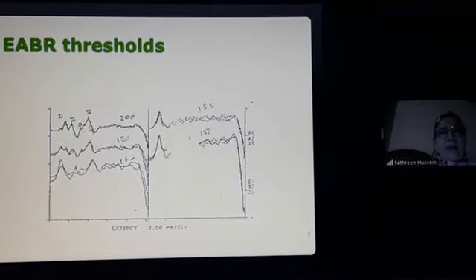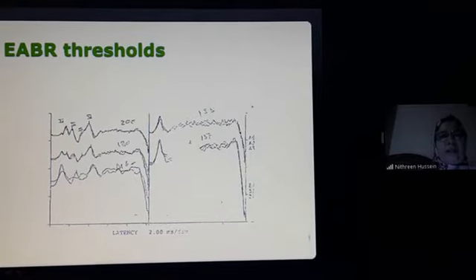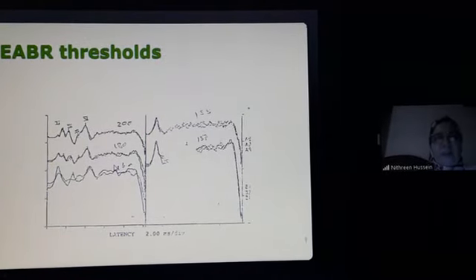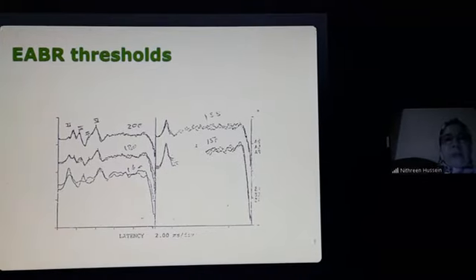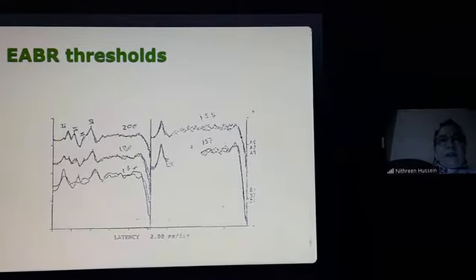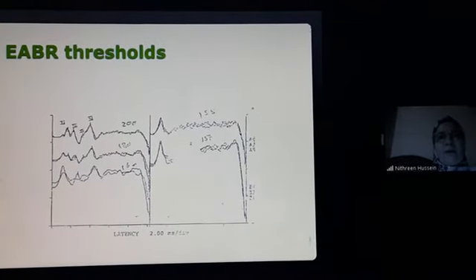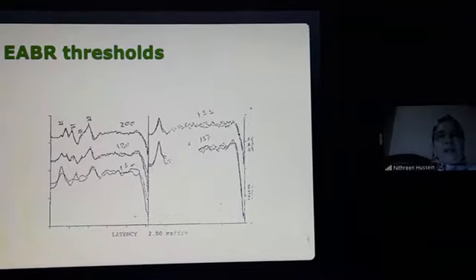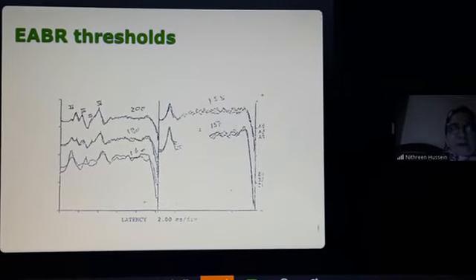These are the electric ABR waves, and we stimulate and go down to threshold and detect the threshold at each electrode. Also, from this threshold, we can find or adjust the T and C levels because there is a similar correlation, like the ECAP, the electric ABR threshold also lies in the upper part of the dynamic range. So we can set the T and C levels around the electric ABR threshold.